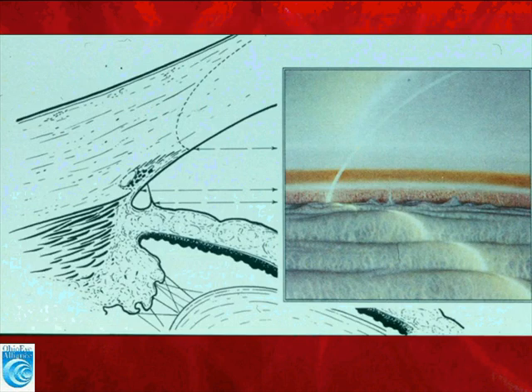In this case, we see a brownish band of pigmentation identifying trabecular meshwork. And how do we know it's trabecular meshwork? Well, look back at the wedge. We see the wedge superiorly in the image, which is identifying Schwalbe's line for us, and the next structure posterior to that is trabecular meshwork. The next white line posterior to that is scleral spur.